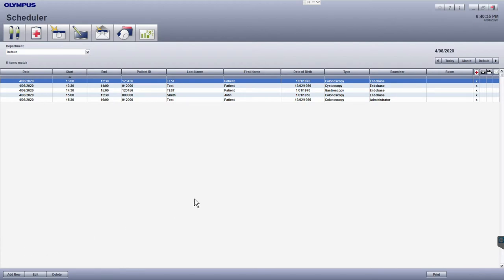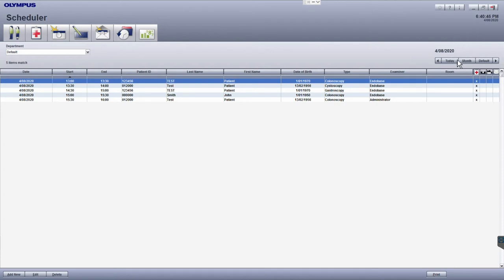First check that the scheduler date is correct, as this is the date that you will be adding examinations for. You have the option to populate your examination list for a future date by changing this scheduler date.